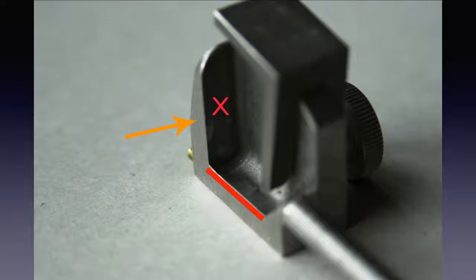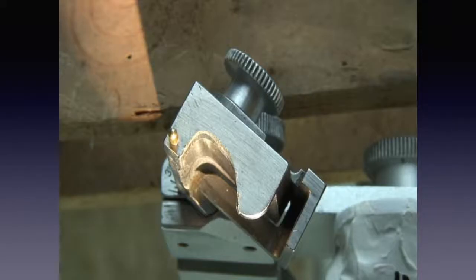If you use a Whip Mix articulator, it is essential to cut away the outer wall to visualize where the ball is when the casts are in MI. Cut back the part with the X on it. When you are through, it should look like this. The lighting in the photograph is a little misleading. We have not touched the fossa, only the outer wall.